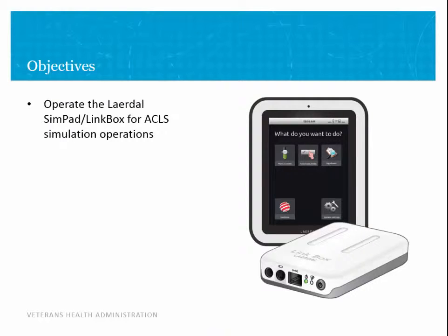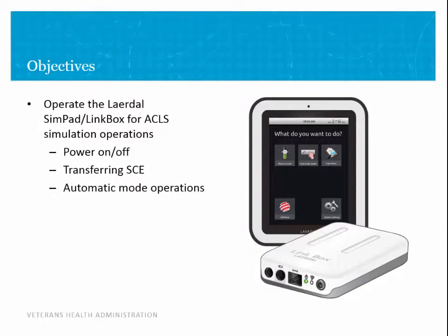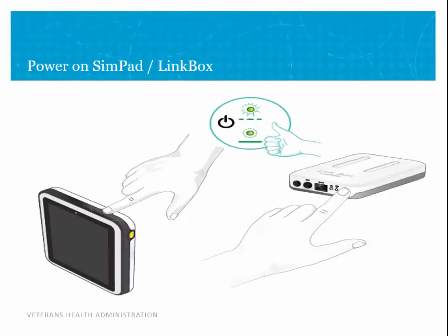In this talk, we're going to discuss the Laerdal SimPad and LinkBox for the ACLS simulation operations. We're going to talk about powering on the device and powering off the device, transferring SCEs, or scenarios, to the device, and automatic mode operations. The SimPad is the controls for the simulation, or the user interface for simulation operations, while the LinkBox provides signals to the mannequin as directed by the SimPad.